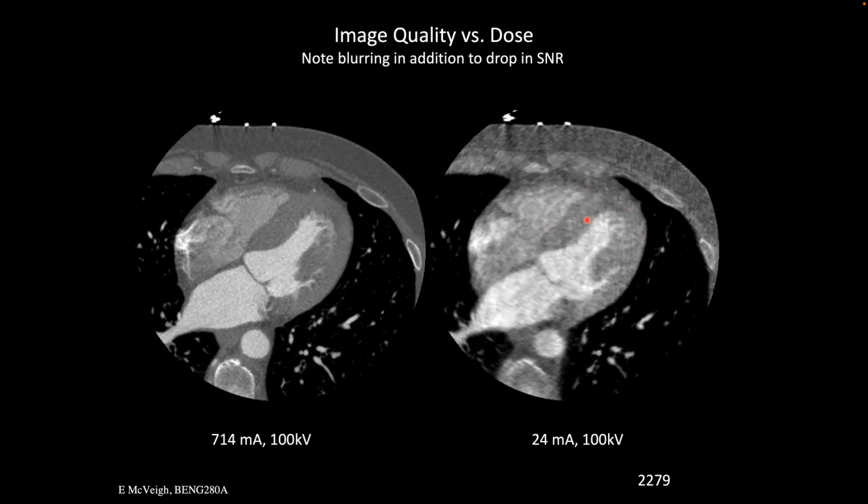So depending on your task, you can acquire images with really low signal to noise, and they're still fine for things like this. Can you get the actual raw data off the scan? Yes, you can. However, there are a number of steps between what is raw data that comes off the scanner and what is the sinogram. And there are many steps, and the first thing they do is encode the raw data. It's not a tricky coding to break, but it's encoded, right?